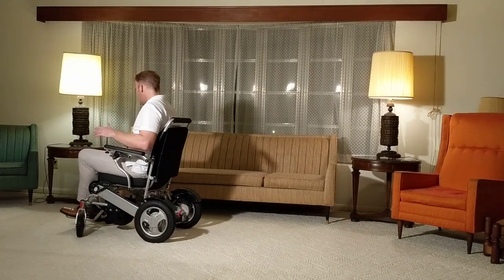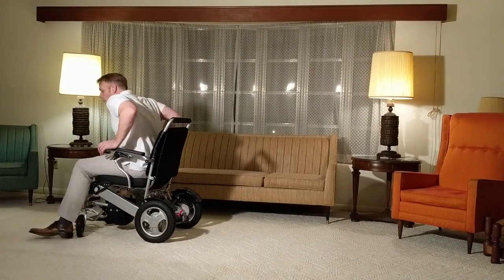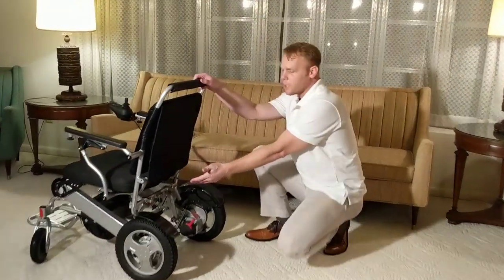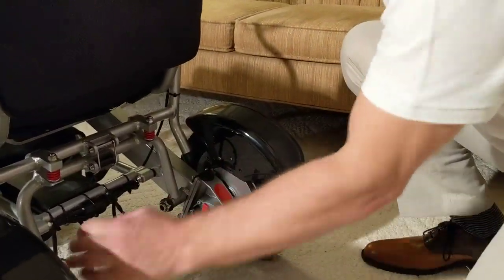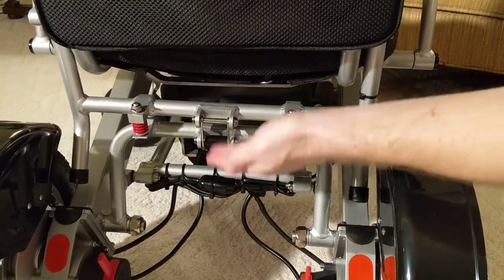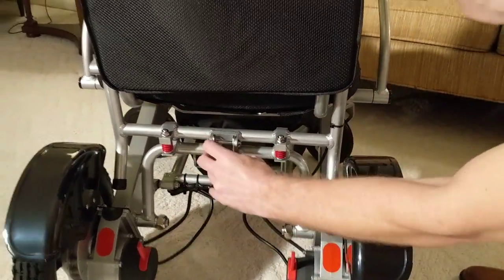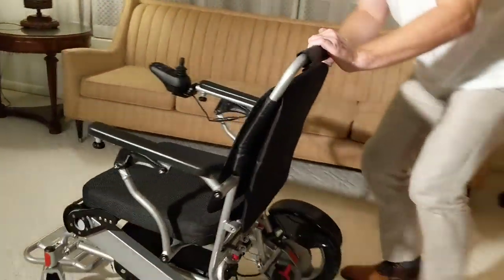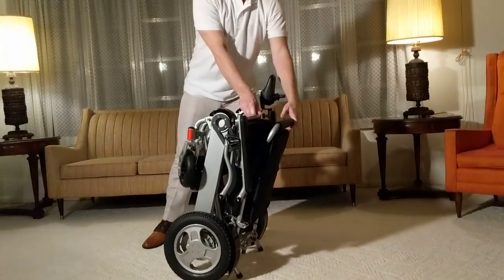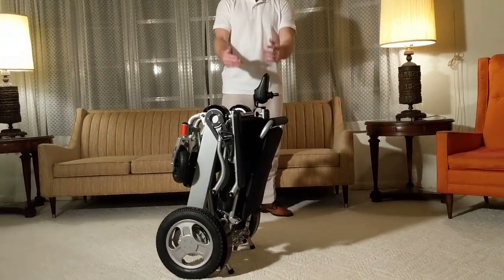The chair goes backwards as well — literally a very small learning curve. To fold this chair up, it's just as simple as the other chairs. Turn the joystick off, release the quick release in the back of the chair, pivot the chair around, take a look at the quick release valve, pull it — and it's so easy and so fast. There you go, the chair is folded up.